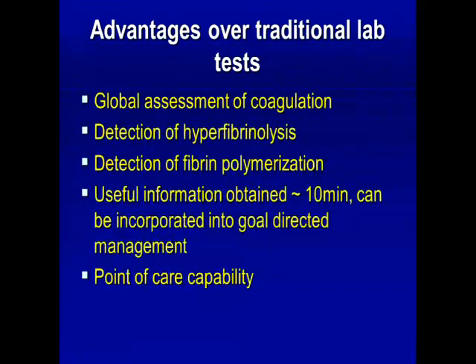All right, so in terms of comparison to previous traditional coagulation lab tests, things like the INR and PTT and quantitative fibrinogen levels, the ROTEM gives you more of a global assessment of coagulation. You have to keep in mind the historical perspective: the PT and the INR were really designed to monitor specific things like warfarin therapy, and were never designed to be used outside of that context, certainly not in the way that we use them seemingly on any patient who is bleeding.